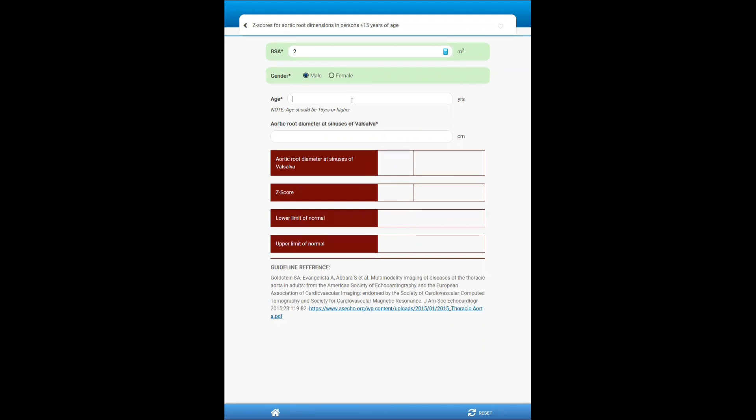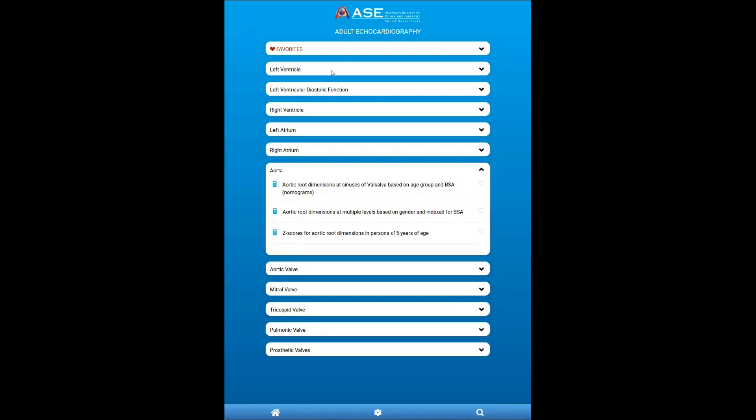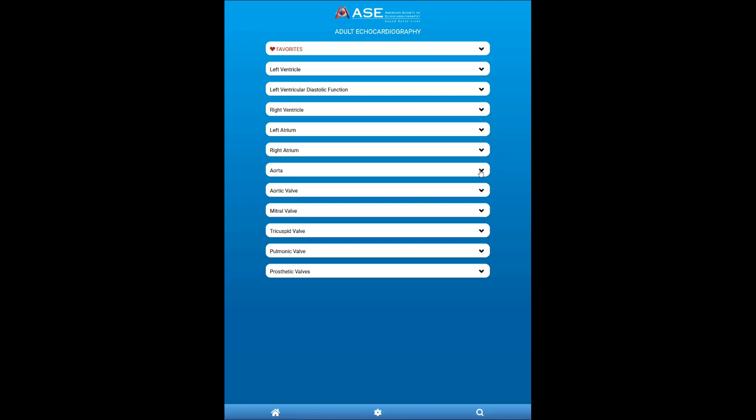So here, for example, if I enter the age, noting that this is not for pediatric patients, this is for individuals over the age of 15, and I enter the aorta root, it will provide me the lower upper limit of normal, whether this is outside of the normal range, and also a Z-score. So really interesting tools that different users can use based on what they prefer in their lab.